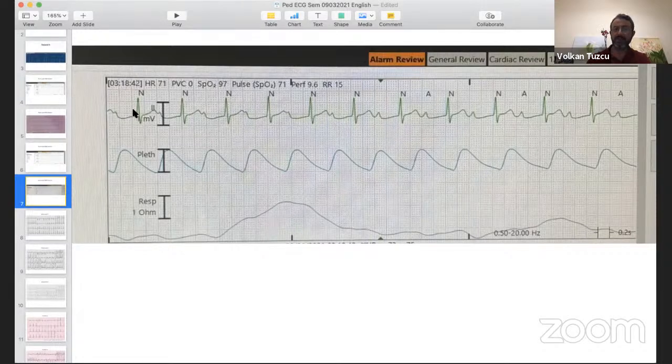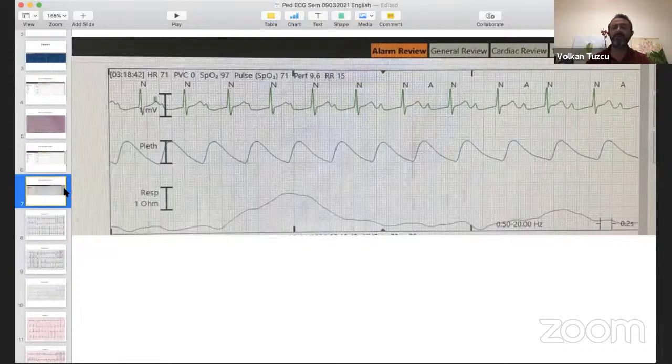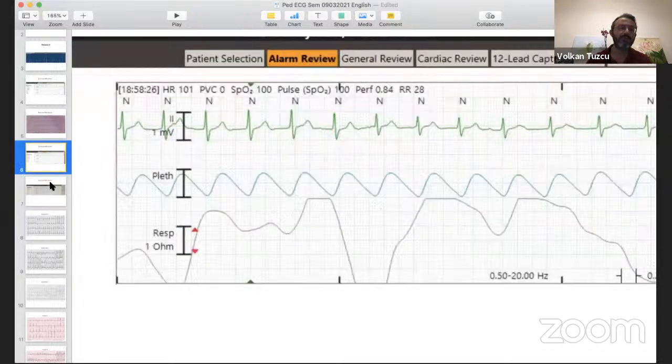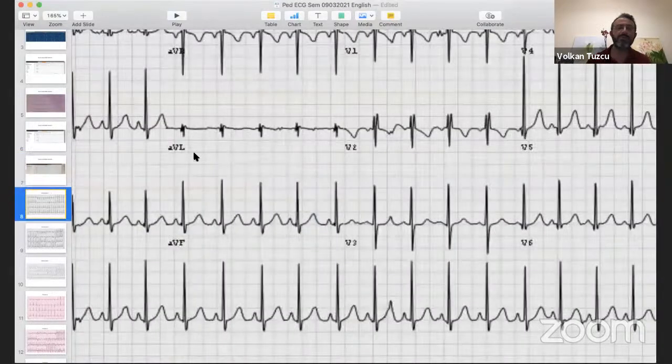As you see now, I think there is no question in any of you, right? When it slows down, you see the P waves, how they come out. And yes, it's almost a 400 millisecond PR interval. So it is possible because they are related, okay? So this was after a device, and it required some steroids, and waiting. The patient improved slightly, much later. So it took some time, and the device had to be removed. So sometimes you can stretch the AV node and you have to watch the rhythm.